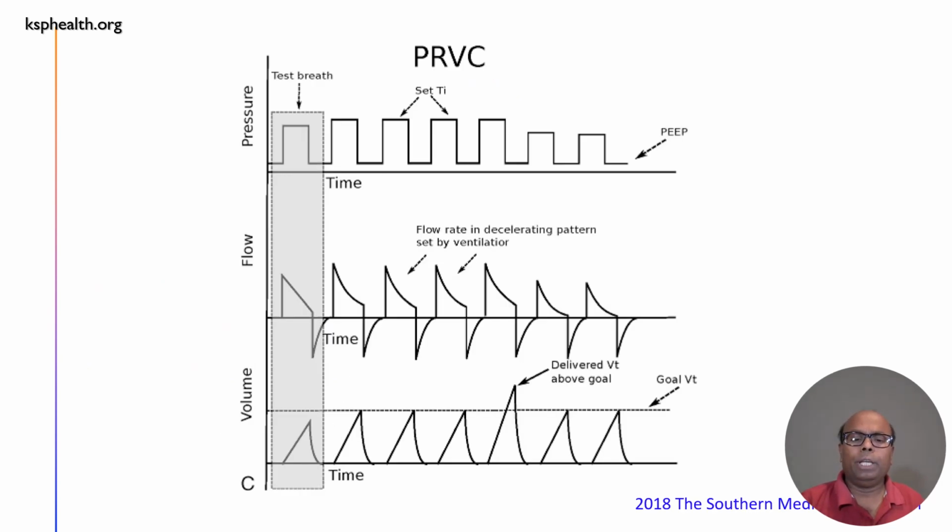So what does it do? It gives a first breath. The ventilator gives a first breath in this mode. Then it identifies resistance and the compliance of the system.